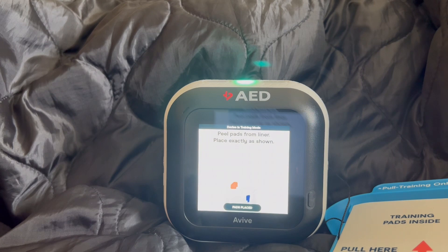Look at the picture on the red pad. Peel off the red pad from the white liner and firmly stick on the patient's bare skin, exactly as shown. Peel off the blue pad from the white liner and firmly stick on the patient's bare skin.